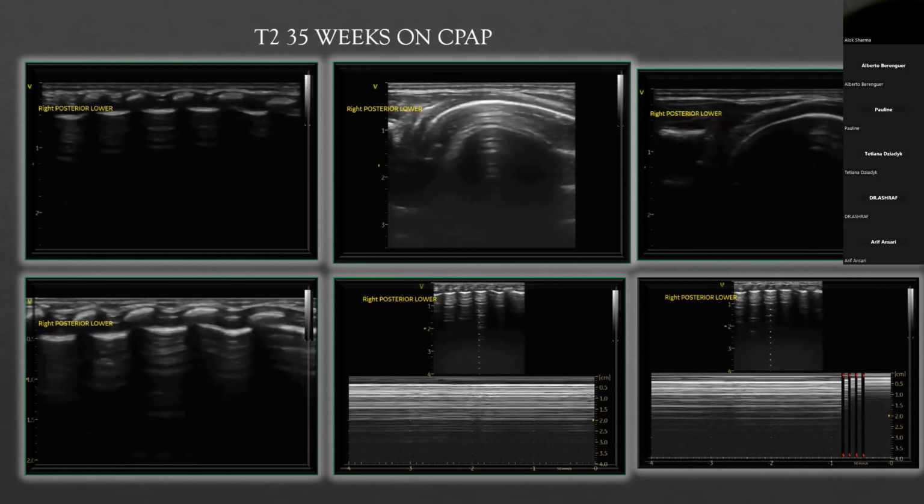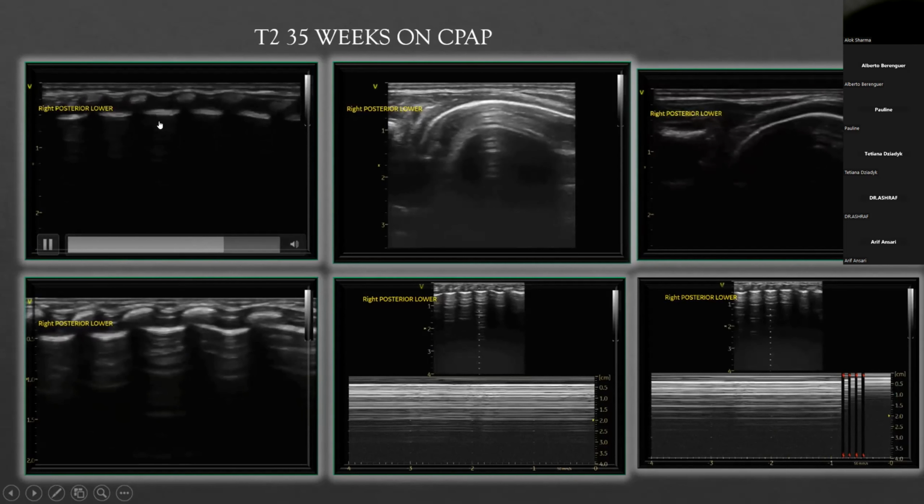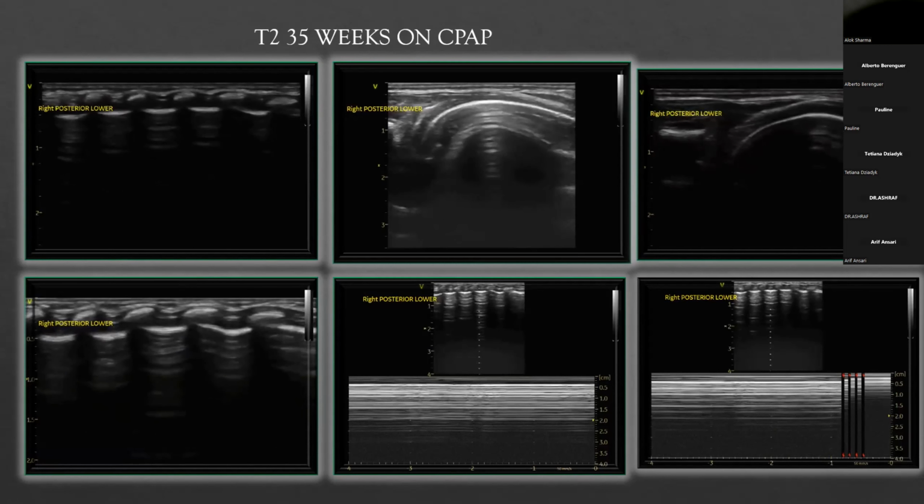Dr. Alec, any other comments? It is good. When I do it, I make it darker for all parts except the pleura to see the sliding like this. It is obvious sliding here. Yeah, no doubt, I completely agree. And that's one good way that you've exemplified it.